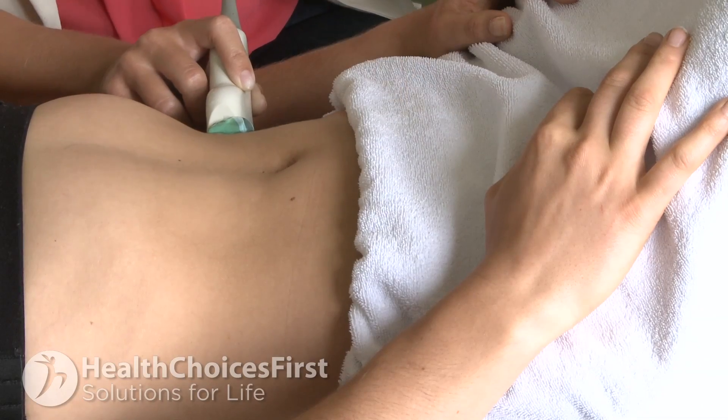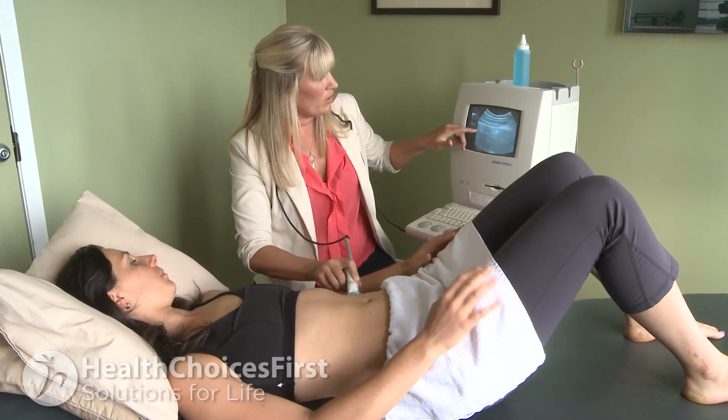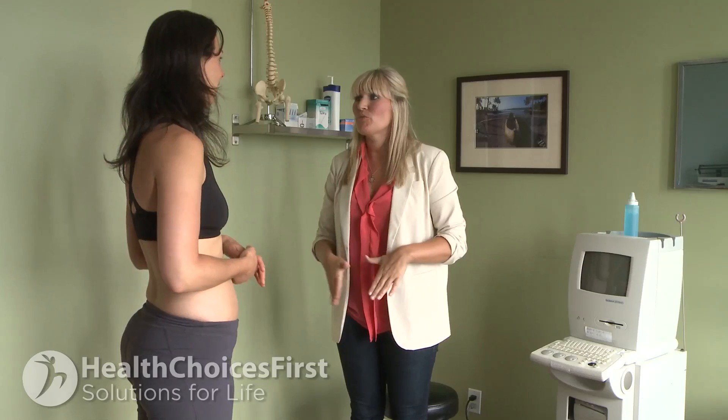The initial assessment should be done quite soon after the injury or after the patient presents to the physiotherapist. The reason for this is so that the physio is able to develop a really good plan for where the dysfunction is in the deep system. The patient can then come and work on rehabilitating once the physiotherapist has decided that their pain levels have decreased and they are ready for a rehabilitation program.